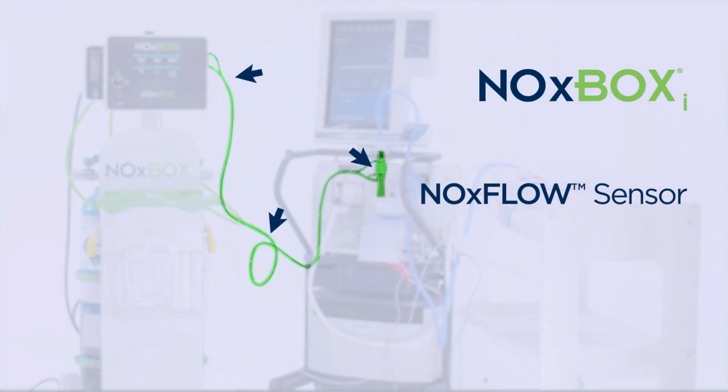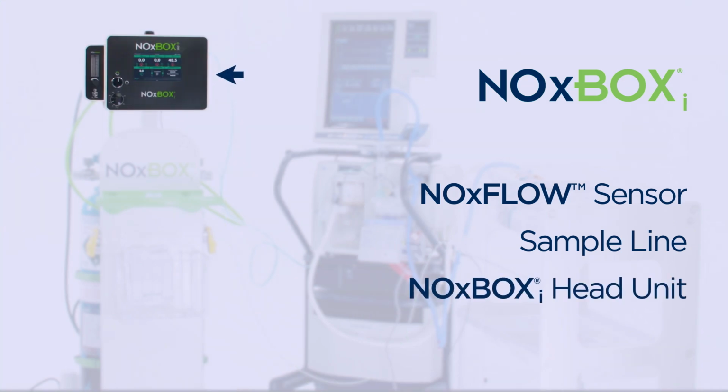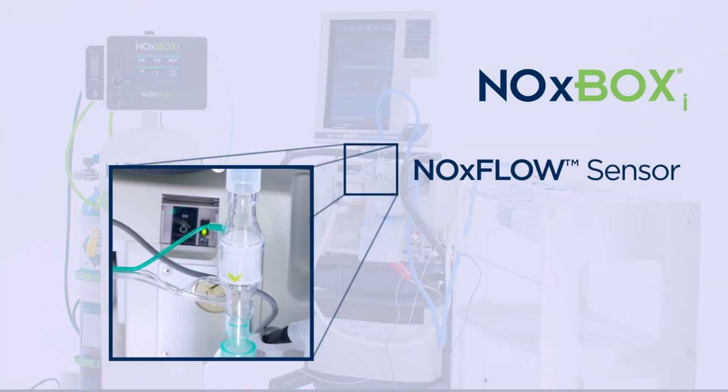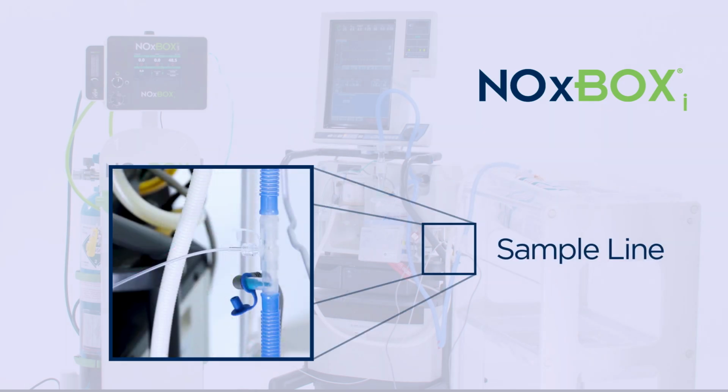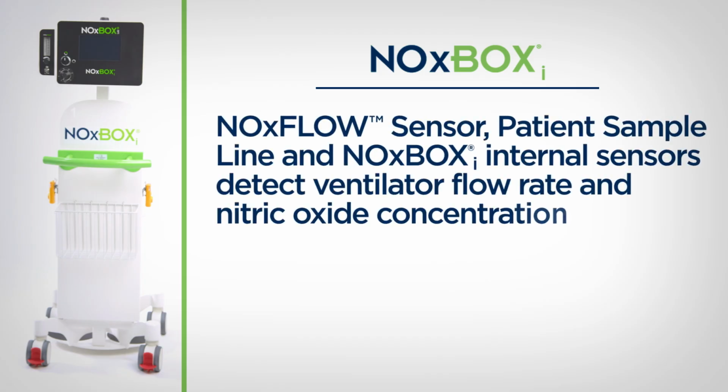The key parts of the system include the NOx flow sensor, the sample line, and the main head unit of the device. The NOx flow sensor is attached in line with the inspiratory limb of the breathing circuit. The patient sample line, connected by a luer port just before the patient Y piece, allows the NOxBOXi system to sample inspiratory gases. The NOx flow sensor and the patient sample line, combined with the device's internal sensors, detect the ventilator flow rate and nitric oxide concentration.